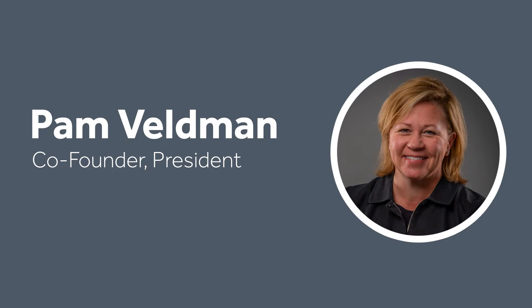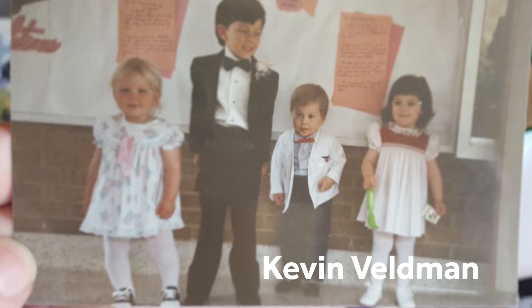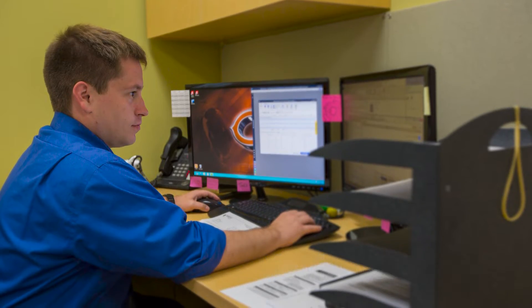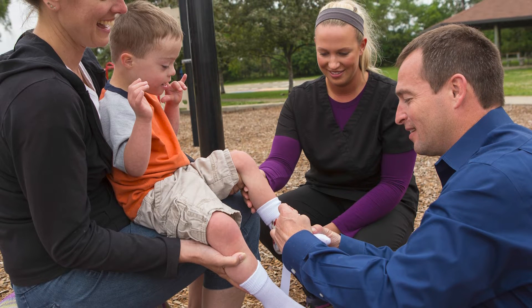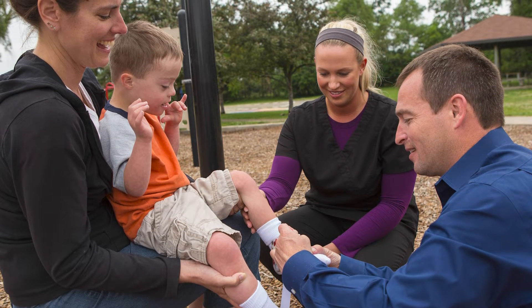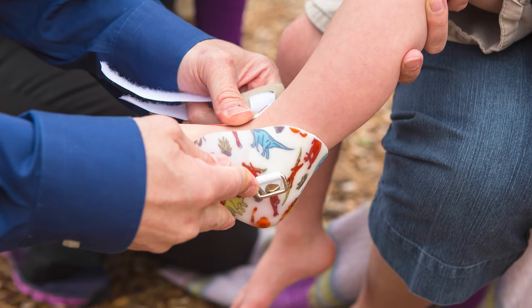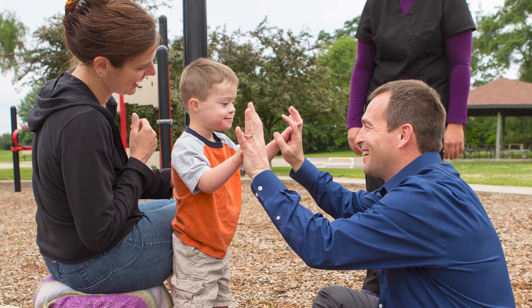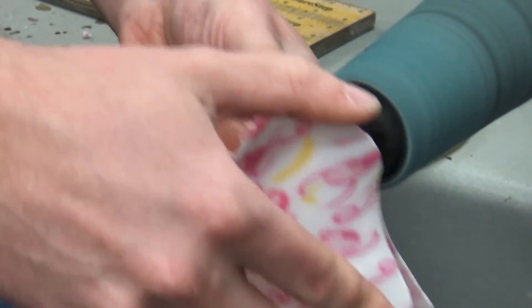Kevin was a big part of the development of SureStep. I remember one time we were at a basketball game — I don't think he was in fourth grade yet — and you could see that he was running a little bit differently than the other kids on the gym floor. Typically, a child who pronates as severely as Kevin did would just go into UCBLs, and that's what I put my patients in all the time. When I saw how that affected his gait, something clicked. Like most orthotists, I always thought about what position they're in and not how they functioned. All of a sudden, there was a switch that flipped. And so that kicked off this quest to develop something that would help him in the right position, but also function better.